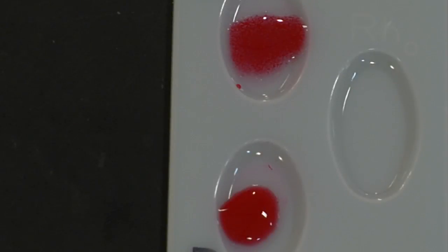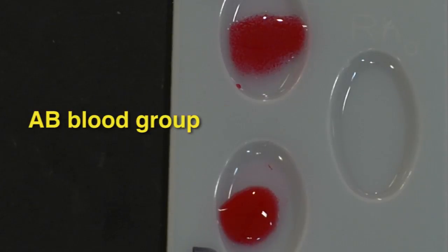Finally, I will observe the result. In this first sample, I see some clumping occurring in both well A and well B. This clumping is called agglutination. Blood that contains A antigens will agglutinate in the presence of the anti-A serum, and blood containing B antigens will agglutinate in the presence of the anti-B serum. This agglutination lets us know that the sample is from someone whose blood is in the AB blood group.